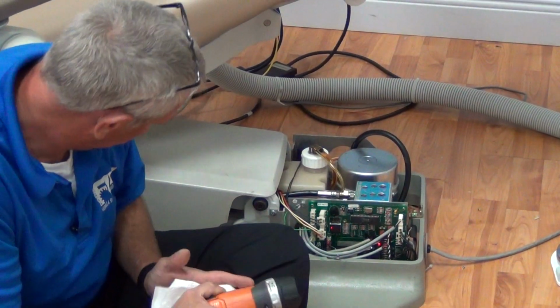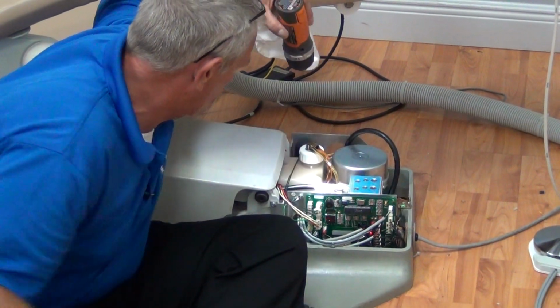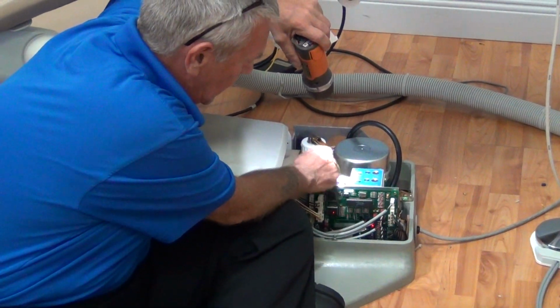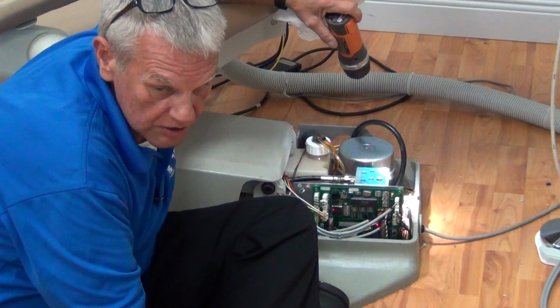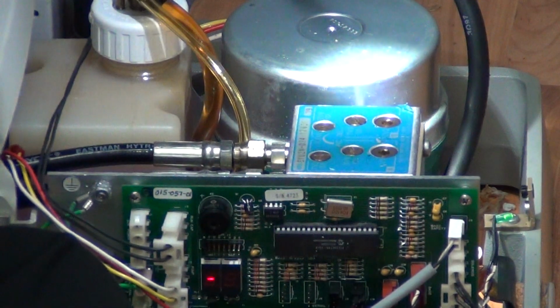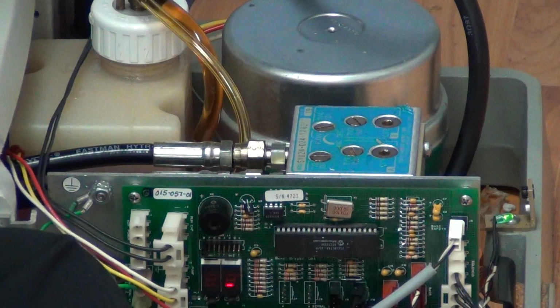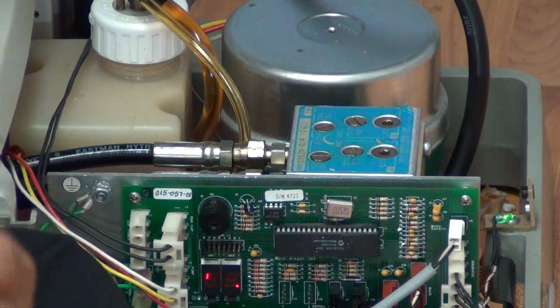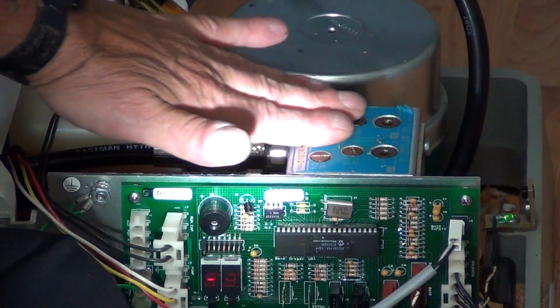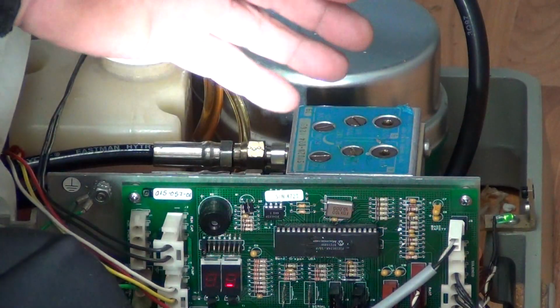Next, we're going to inspect the chassis, the base, and the internal chassis on the base, as well as the solenoid manifold. We're going to use our senses, guys, which I call for you to do many times. God gave us feel, touch, smell, any number of things. Keep your hands clean. Use your paper towels to keep the slime off your hands. Actually run your hand over gently. See if you feel oil or sliminess.